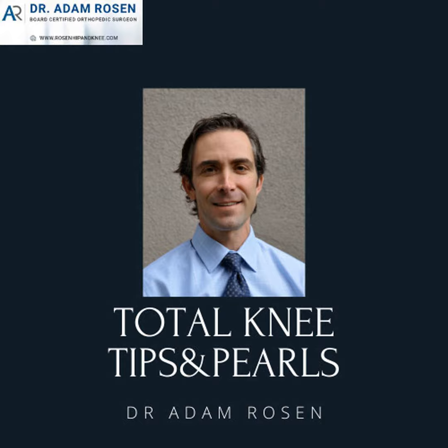There's really no issues with the stability of the implant. And also all of your collaterals and things like that are all intact. So that's your type 1. So that's if you're lucky, revision, it's loose, no major issues. And when you treat these, you can pretty much treat these with your regular revision implants.